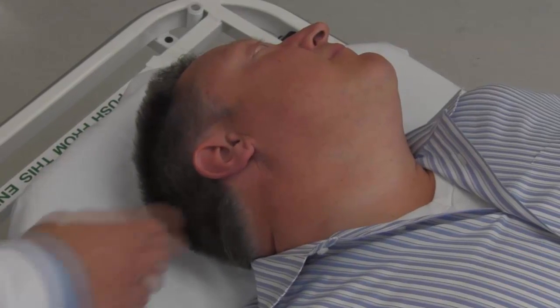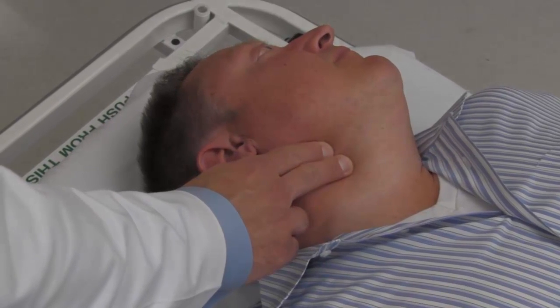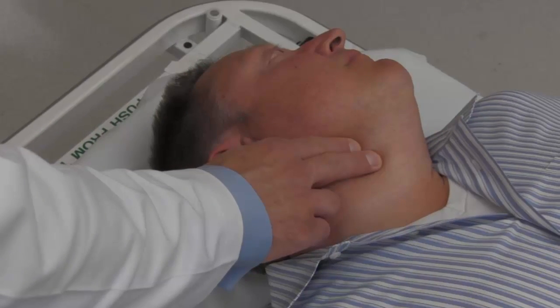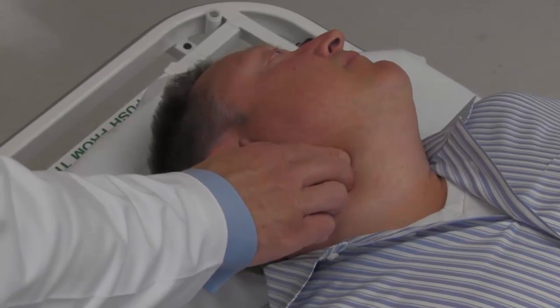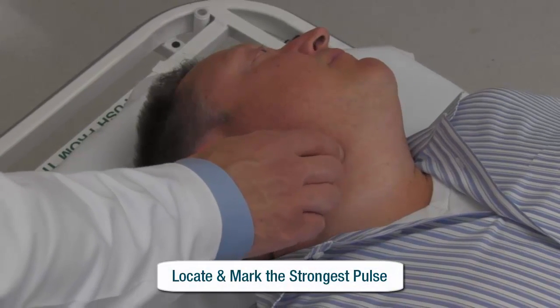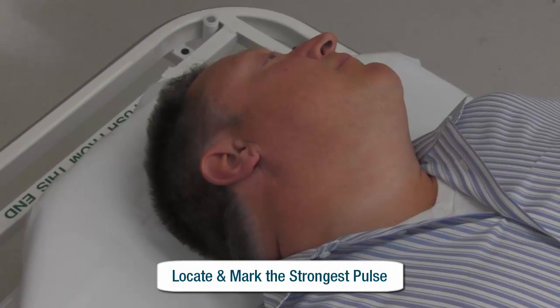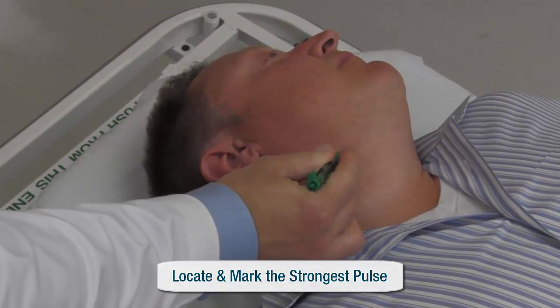Begin by palpating the carotid artery just below the patient's jaw with multiple fingers. Continue to reposition the fingers until a carotid pulse is located. Once located, attempt to pinpoint the exact location of maximal pulsation by transitioning to palpating with a single fingertip. Make a mark on the patient's skin at this point.